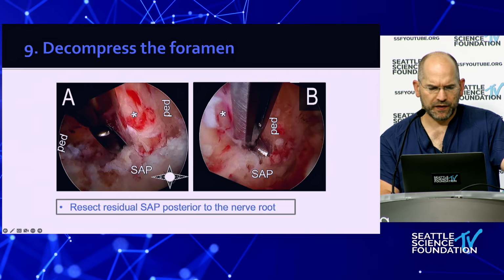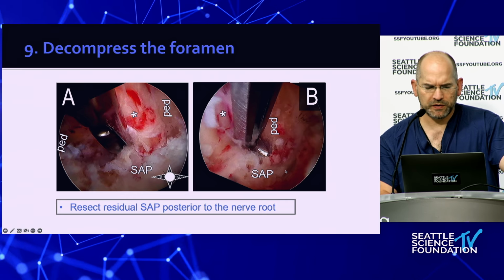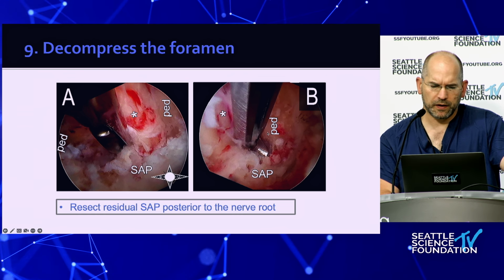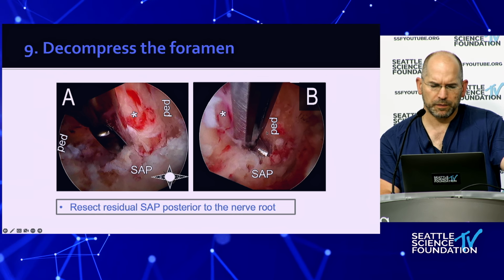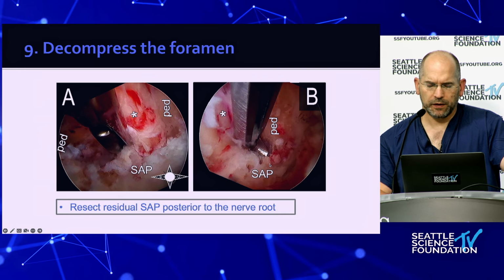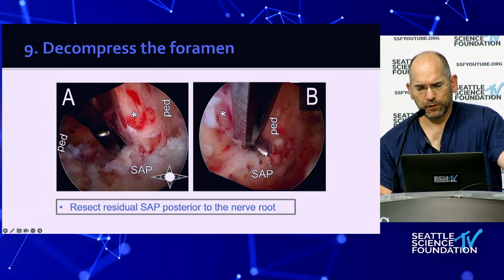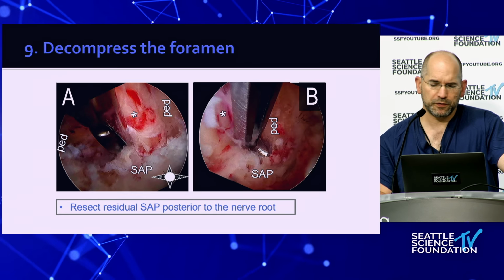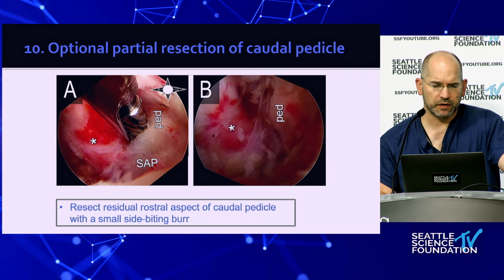And then this is one of my favorite things here about the cervical foraminotomies. There's no question when you're done because you can typically see the pedicle, the inferior index level pedicle. You take a small Kerrison and you bite right along that, unroof that, and you're done once you have the nerve root exposed beyond that lateral aspect of the pedicle. So the end point of this procedure is very, very clear.